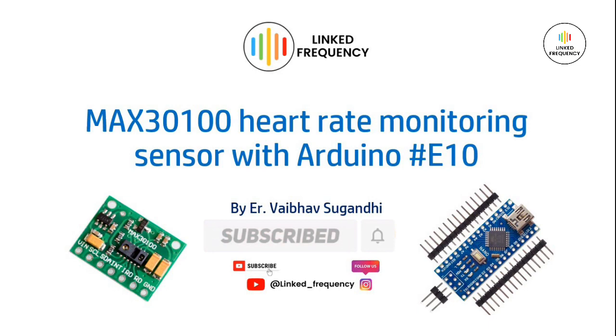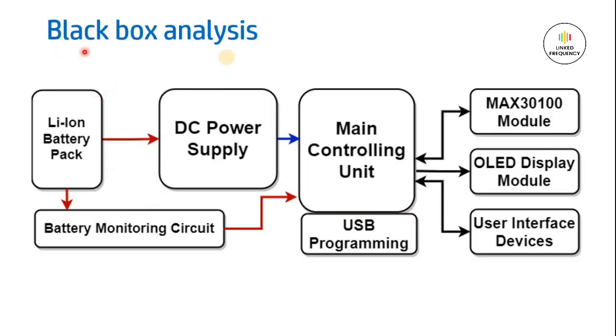Let's start with the design of this particular project with the black box analysis. Here we have a black box analysis for our project. This is a so-called project. Why? Because we are not designing any module further. We are developing one kit, or a project, which includes two or more modules integrated together. First thing is we are using a lithium-ion battery pack so that this entire project will be portable.